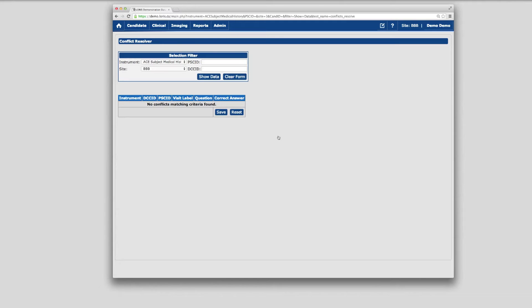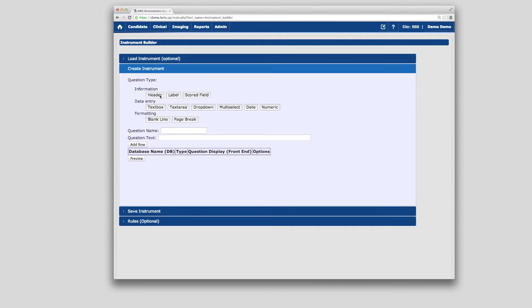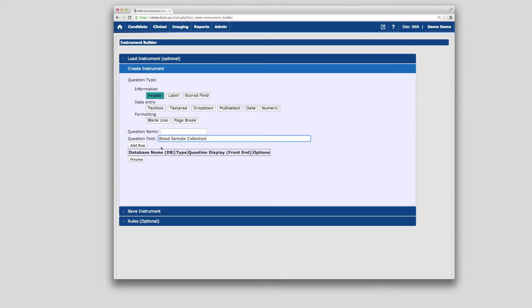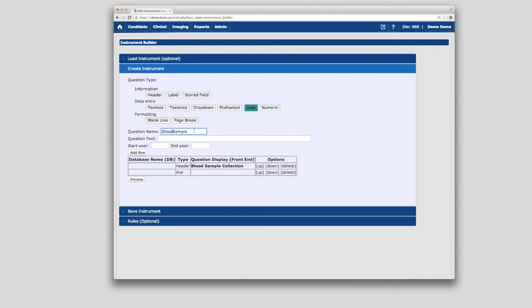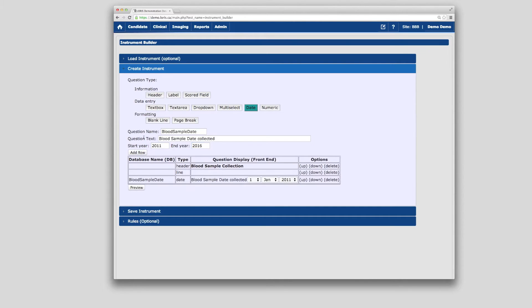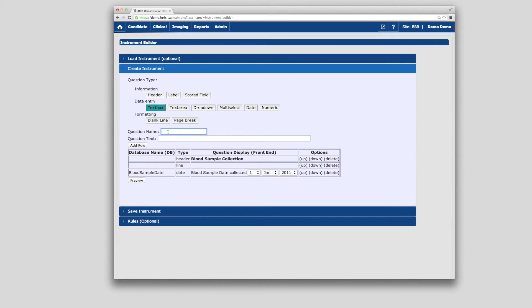Next, we'll show how clinical and behavioral instrument forms are added into LORUS. Instruments are added in one of two ways. The first method is via the Instrument Builder module, found under the Admin section. This module provides a user-friendly way for users to create and code their own test forms with no technical knowledge. For each question, select a field type and enter the question details, adding each response as you go. Field types include text boxes, text areas for larger comment fields, drop-down select boxes, multi-select boxes, dates, and numeric fields.